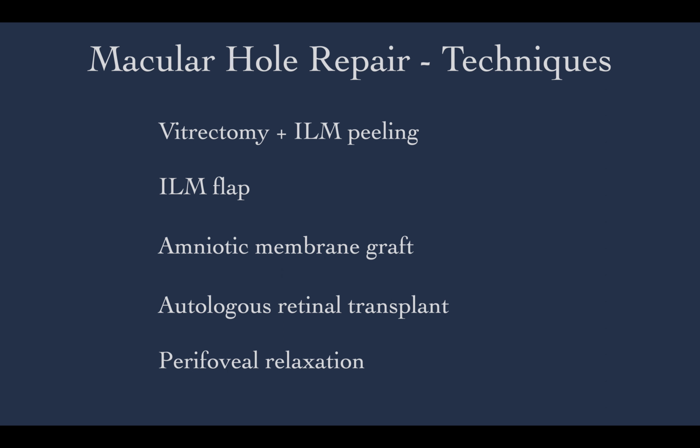This has been a standard technique for several years for patients with small to medium size and primary macular holes. Closure of vitrectomy with detachment of hyaloid and ILM peeling has been achieved in over 90 or 95% of the patients.